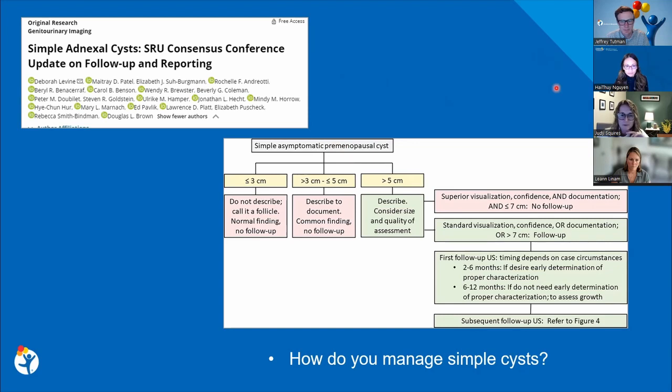Yeah, I think we always forget about how expensive pelvic ultrasounds can be. It's no radiation, but obviously depending on where you are, they're not cheap studies. Right. And I know that was one of the interesting things with that scoring scale that Leanne had shown from Cincinnati. They actually have a specific paragraph in that paper that says we should consider not even doing Doppler, even if there's concern for torsion, because the Doppler charge is really quite expensive. I completely agree. It doubles the price at most sites. Right. Yeah.